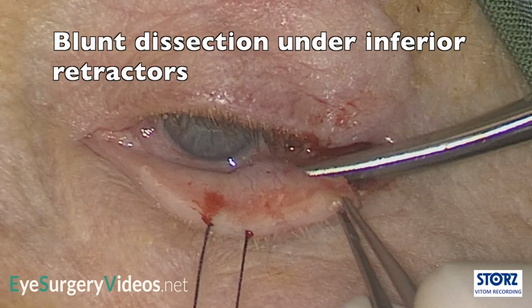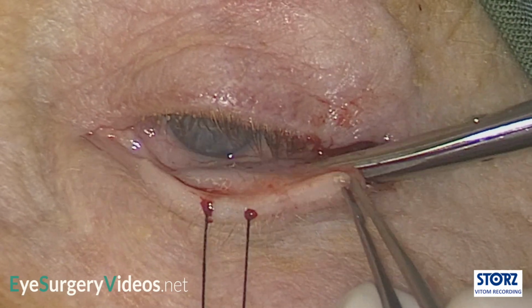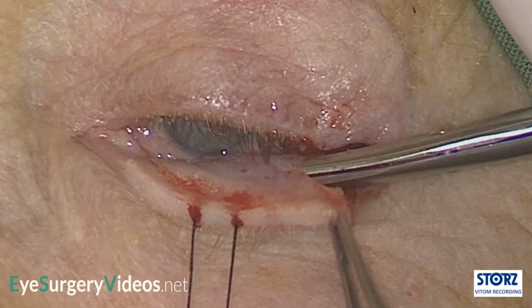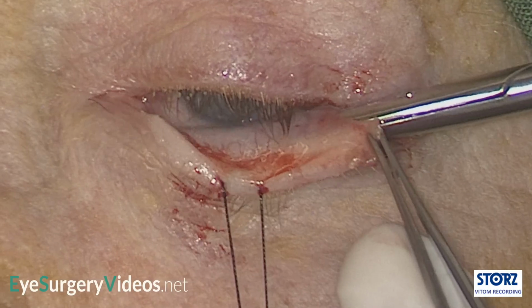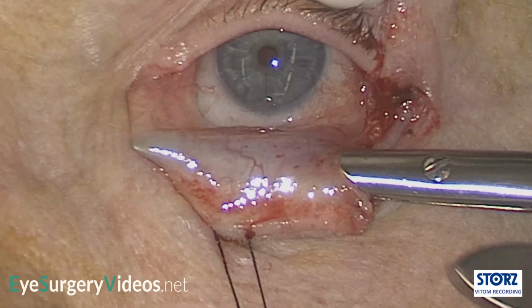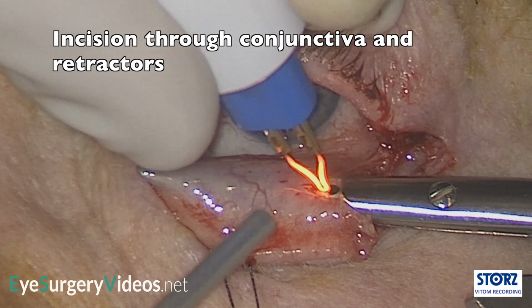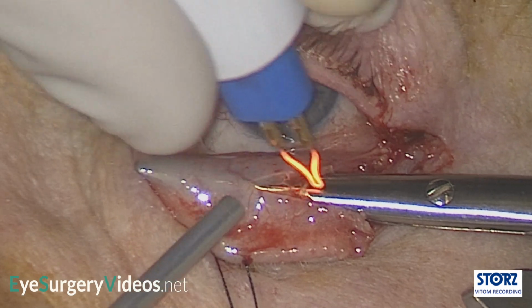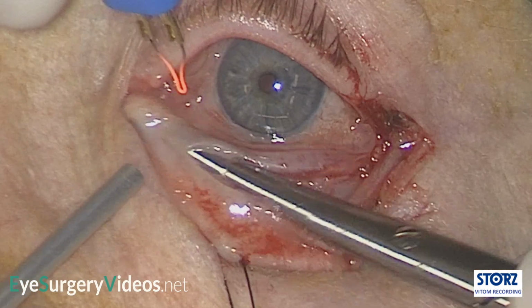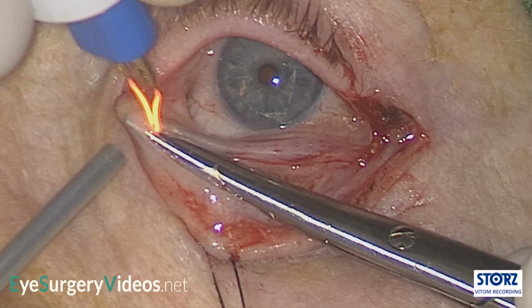www.eyesurgeryvideos.net. But, briefly, a small lateral canthotomy incision is made, followed by lateral canthal tendon cantholysis. Straight, sharp scissors are spread just inferior to the tendon to create a small prolapse of orbital fat. The scissors are then passed into this pocket and medially posterior to the retractors. The conjunctiva and lower lid retractors are incised a few millimeters inferior to the tarsal plate with a hot wire or cut with scissors.